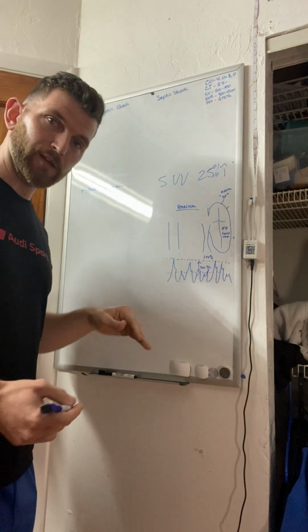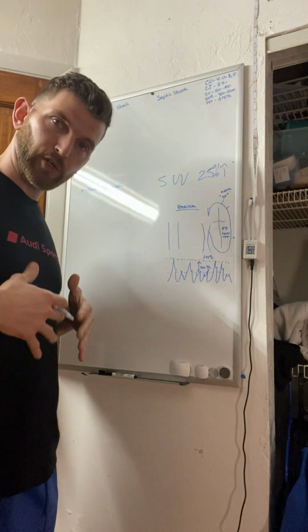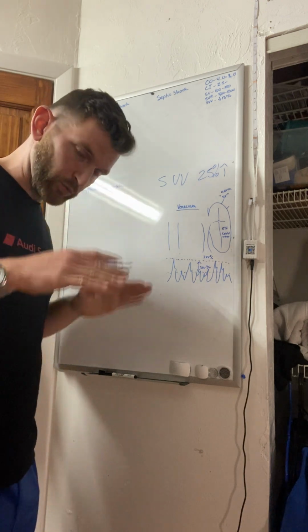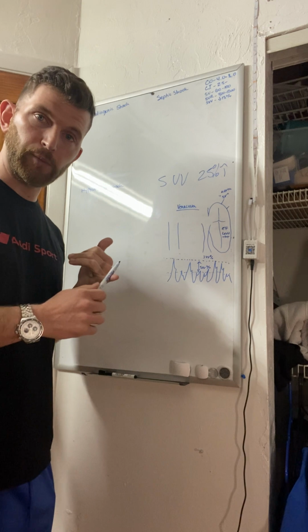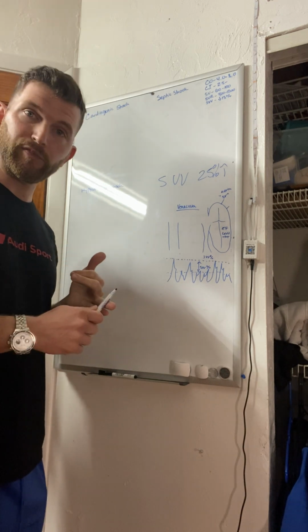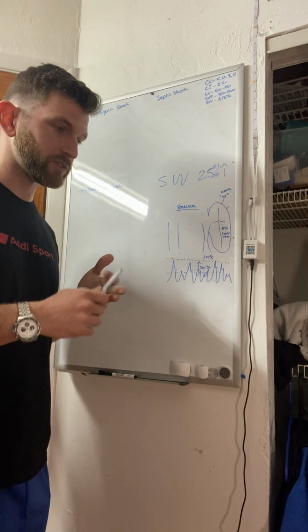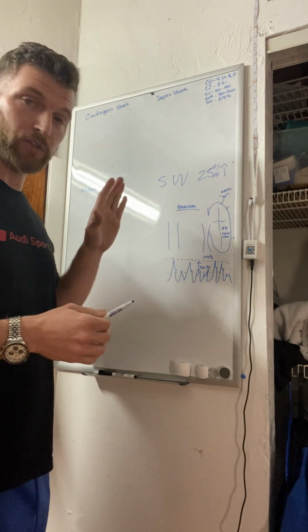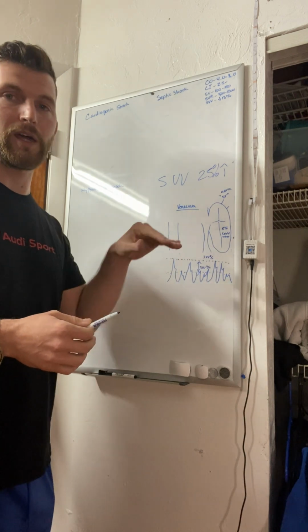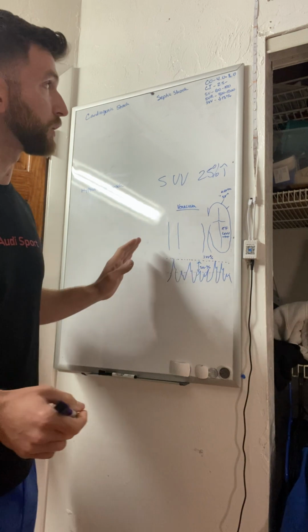You lay their legs flat, their stroke volume slowly creeps back down. That fluid has returned from the core and just went back down to the extremities. What does this patient need? Well, they got low hemoglobin, they need blood. If they're in septic shock, then they need fluids. If they're dehydrated, they need fluids, potentially pressors. But the overall consensus is whatever the fluid depletion is, we need to replete that fluid, okay? So that, in a nutshell, is how SVV works.